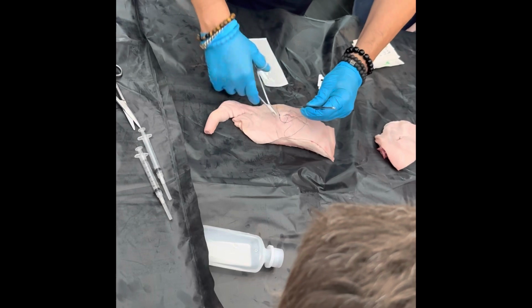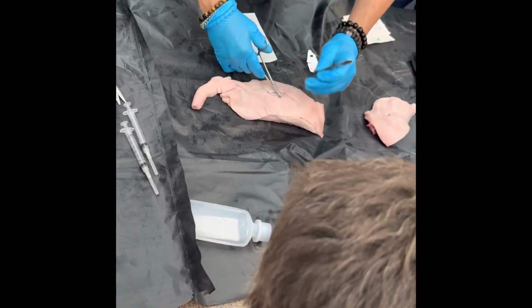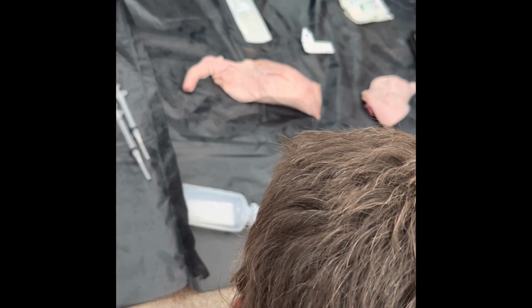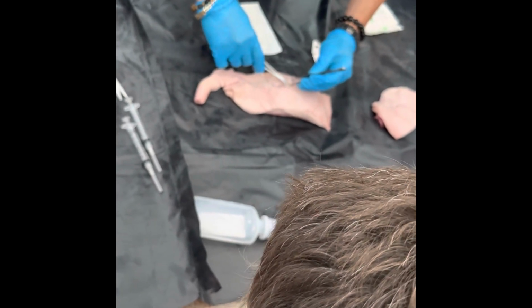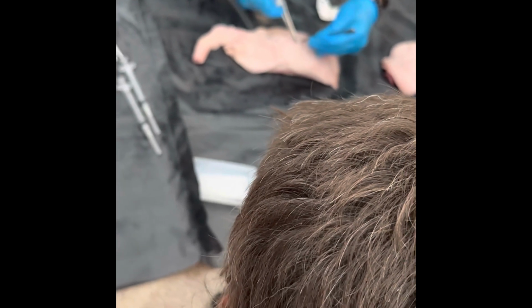Pigskin is a lot tougher than people skin, okay? Well, that's good to know. If you can do pigskin, you can do any skin at all. Make sure it doesn't knot up. Okay? Pretty easy, right? So it gets in a tangle. Yeah, when it gets tangled, it's a pain. It's not as close together as I thought. I don't need it that close, especially because you're doing it in a hurry.